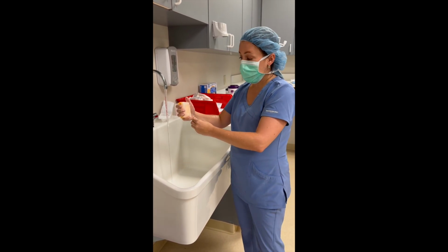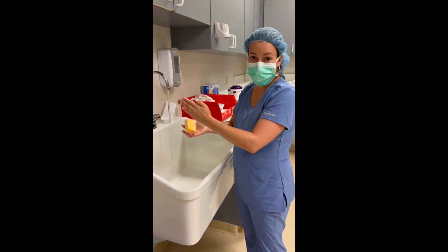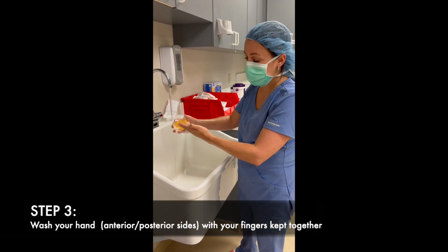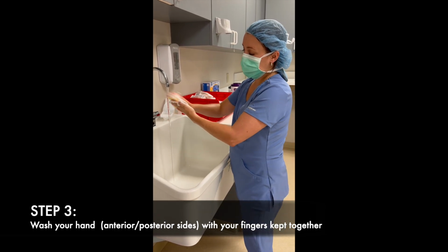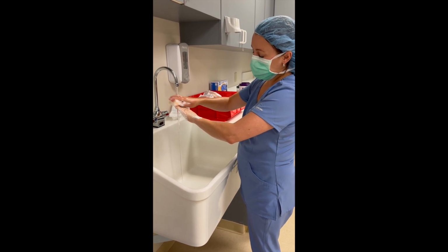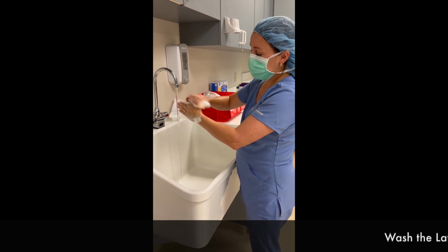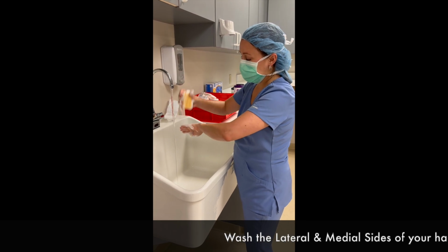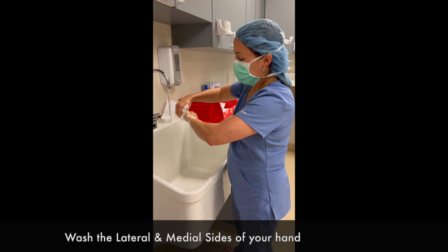So now, I'm going to get rid of this side. I'm going to flatten my hand out, and now I'm gonna wash the anterior and posterior and the lateral sides of my hand, okay? Same concept. And if this is dry, wet it again. No big deal, all right? 1, 2, 3, 4, 5, 6, 7, 8, 9, 10. Flip it. 1, 2, 3, 4, 5, 6, 7, 8, 9, 10. I'm going to do the sides. 1, 2, 3, 4, 5, 6, 7, 8, 9, 10. Same right here.